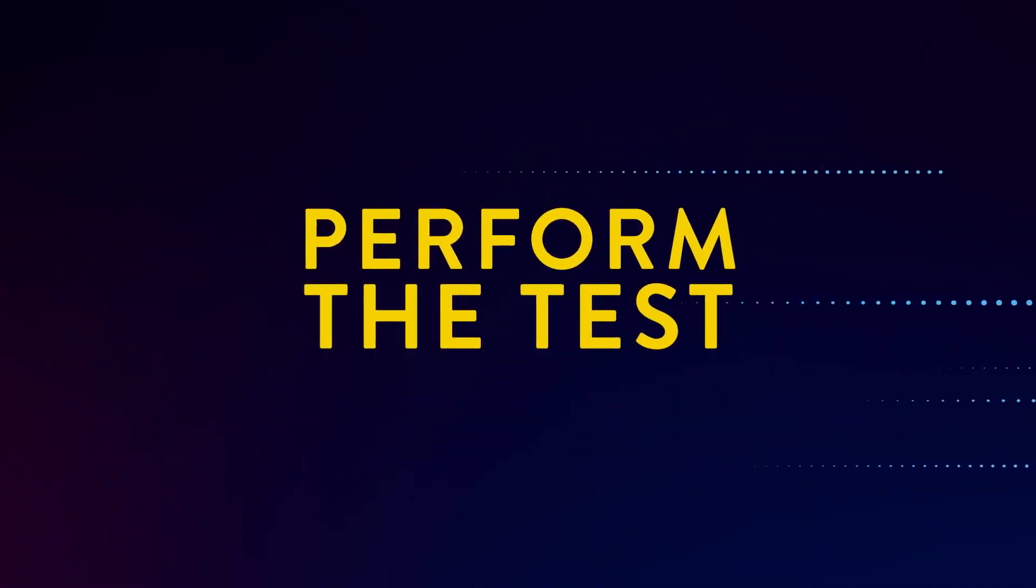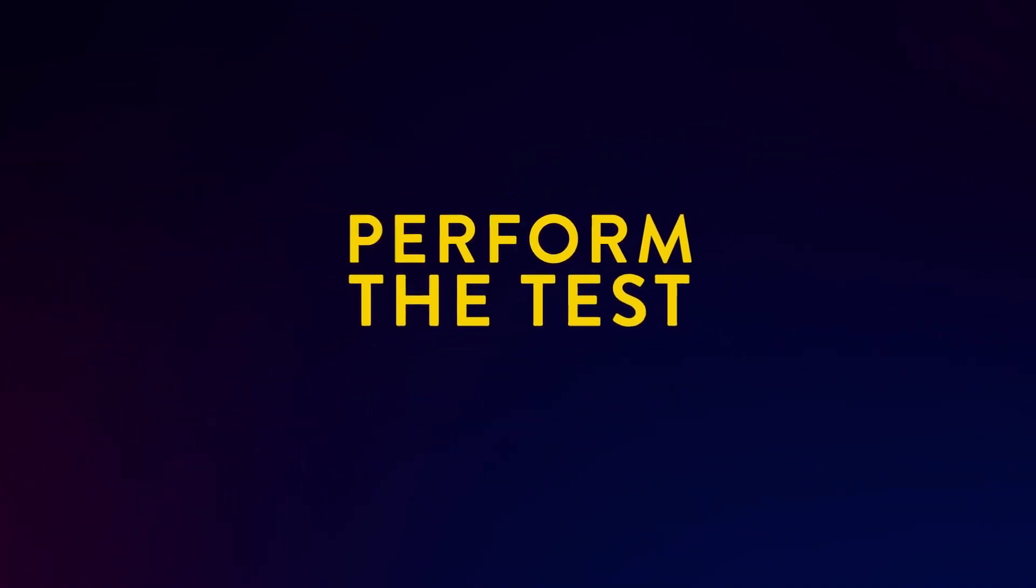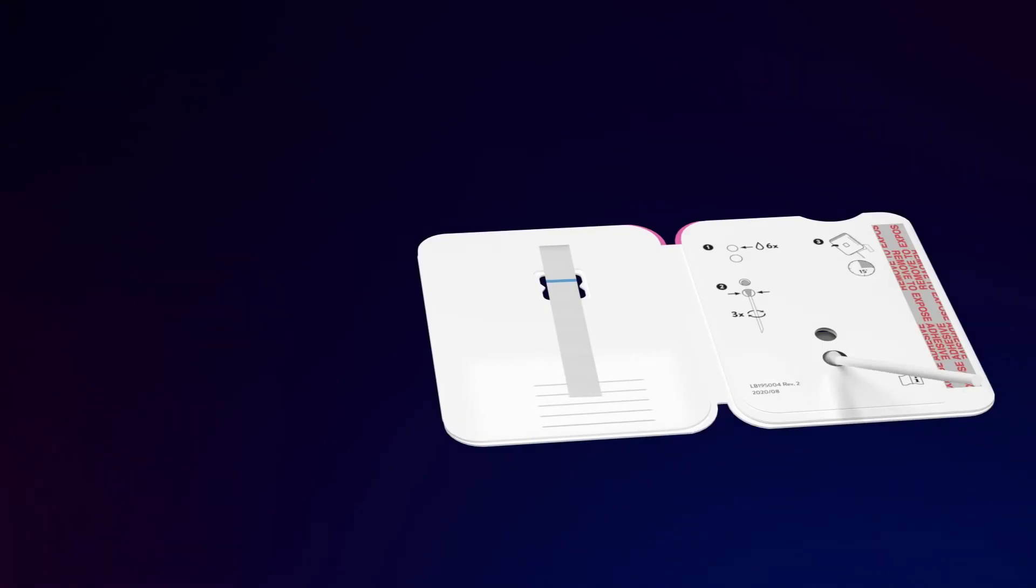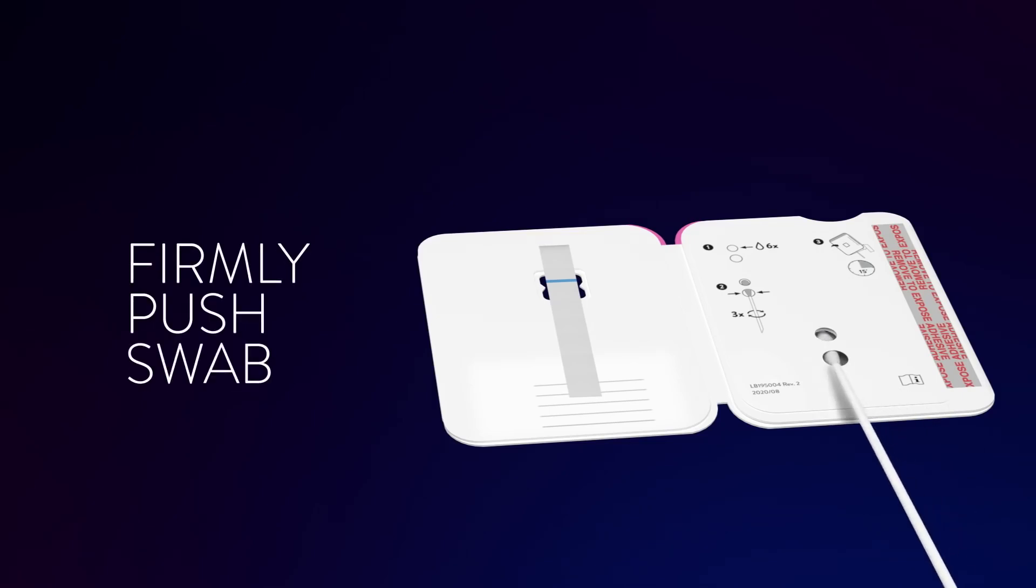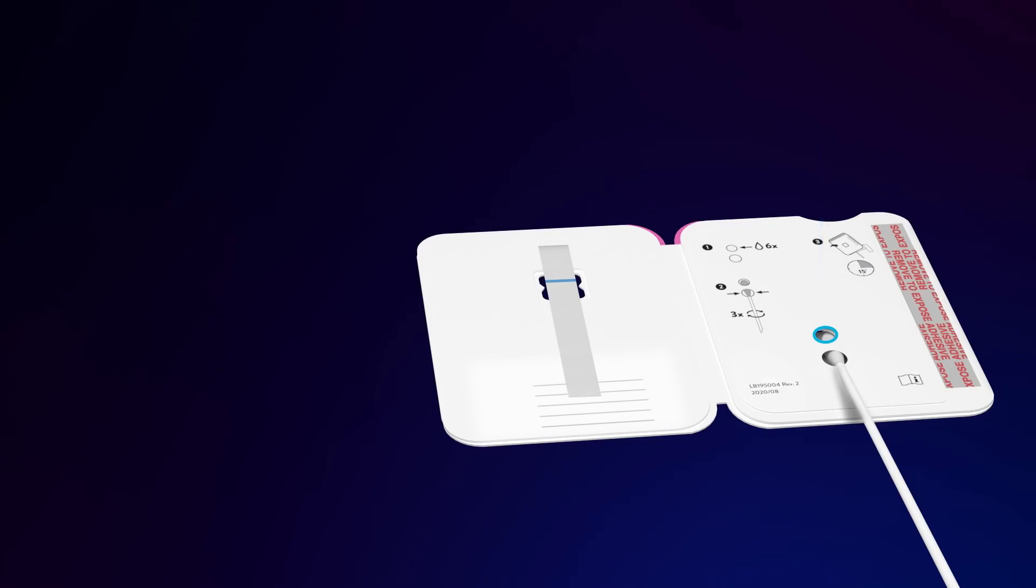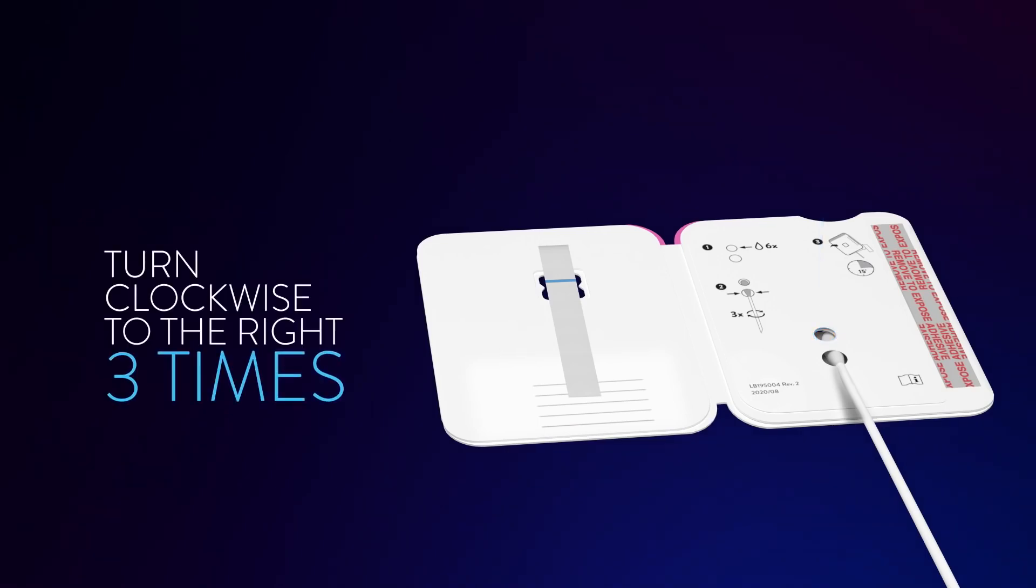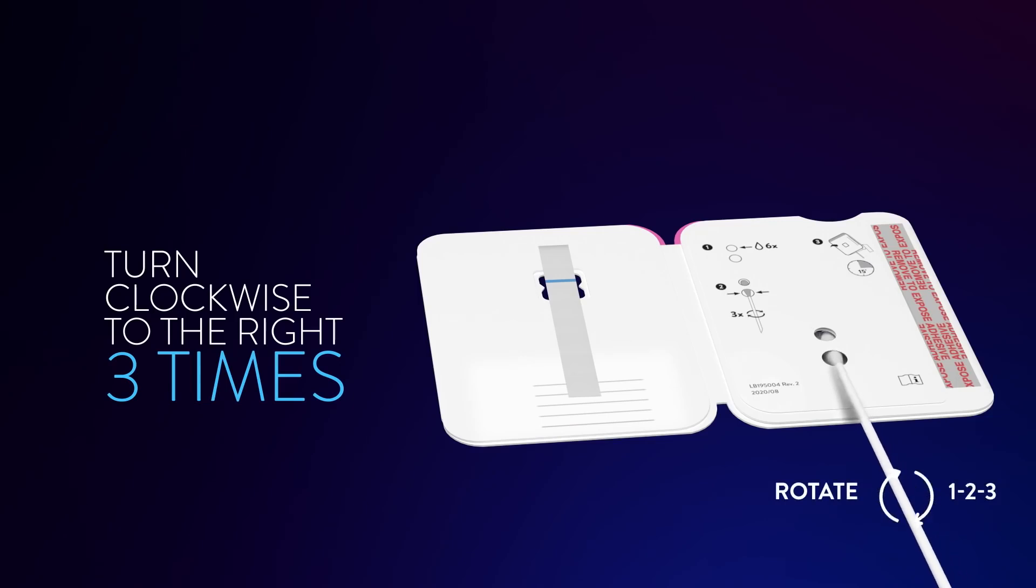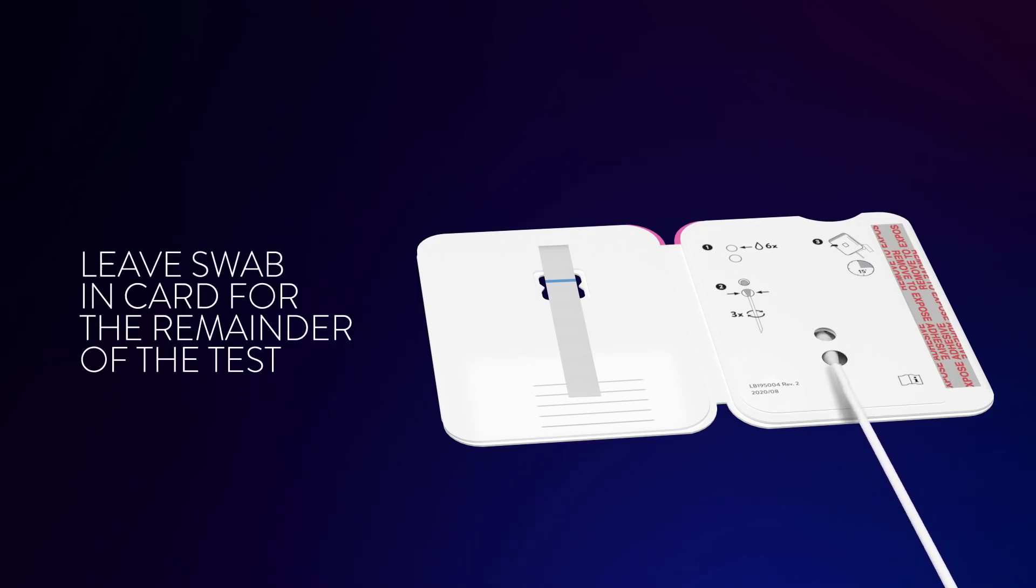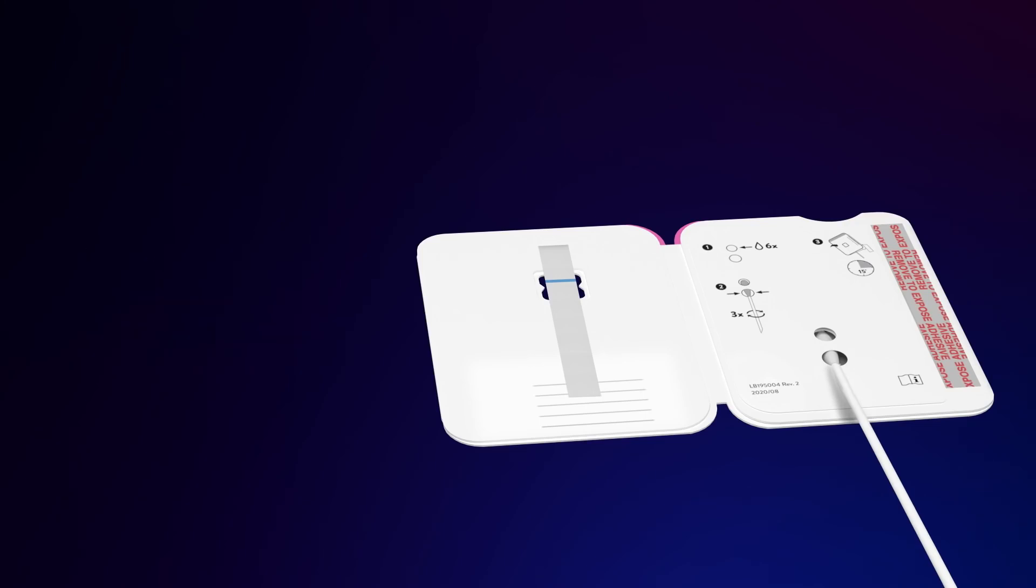Next, perform the test. Keep the card flat on the table. Insert the swab tip into the bottom hole. Firmly push the swab tip from the bottom hole until it is visible in the top hole. Do not remove the swab from the card. Turn the swab to the right, clockwise, three times to mix the swab with the drops. Do not skip this step. Leave the swab in the card for the remainder of the test.